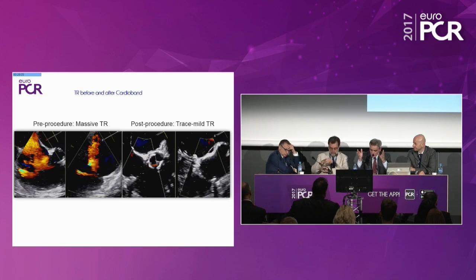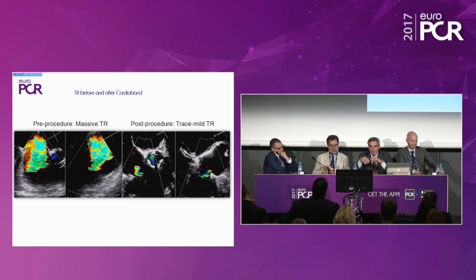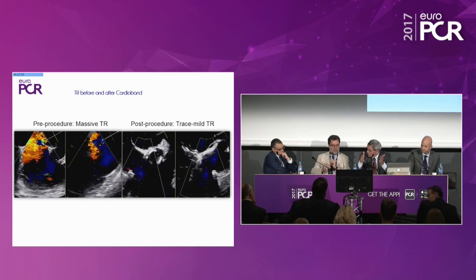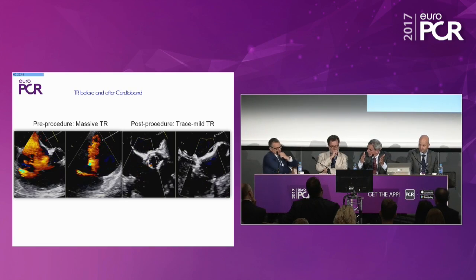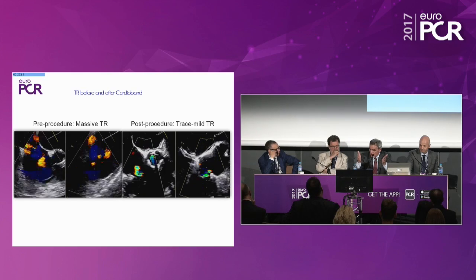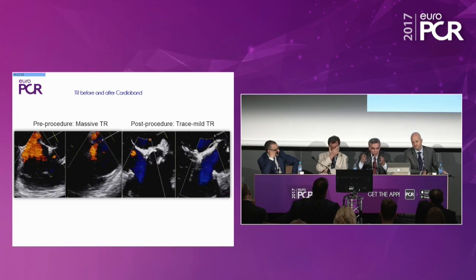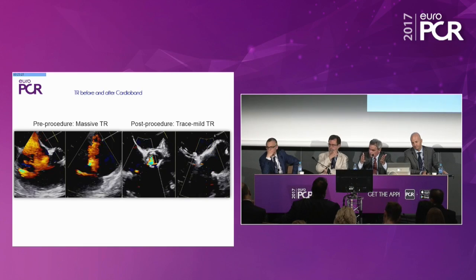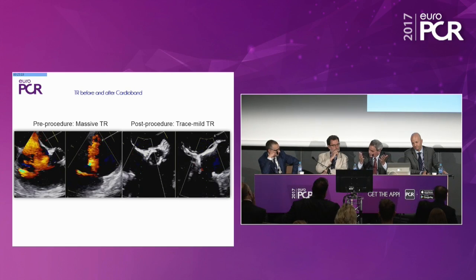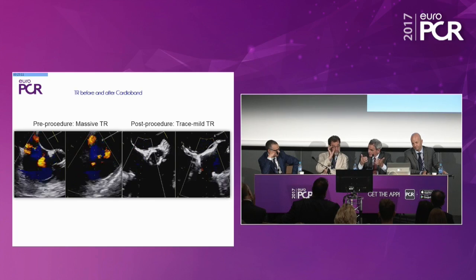If we discussed before the difference between surgery and the Cardioband in treating patients with severe MR and TR, one of the major differences that, of course, we are mentioning all the time but did not specifically address is safety. If you would treat such a patient population with such a poor LV function and these comorbidities, you would expect a higher peri-procedural mortality, as has been shown also in the large series of mitral patients. And this is very much what we all appreciate, that the procedure can be done step by step, very carefully, very slowly, very similar to the MitraClip. So I think we should all shortly comment on this, that we all have a very good feeling that we can treat these very sick patients with the Cardioband without being at risk that the patient doesn't survive the intervention.